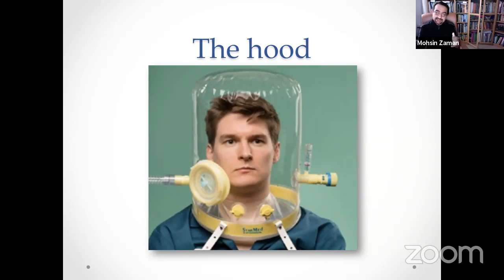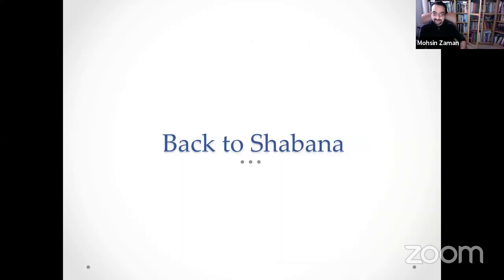The hood is actually better tolerated than the masks, especially in people who are claustrophobic. But keep in mind that putting the hood on has its own complications. And there are issues about aerosolization when it comes to patients on large wards with COVID-19.